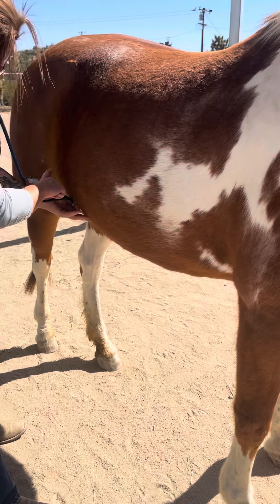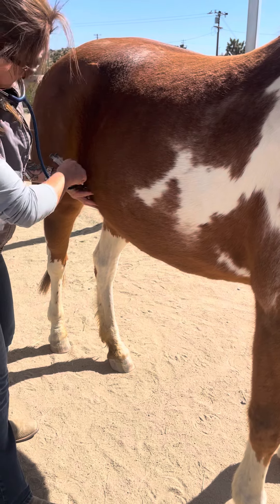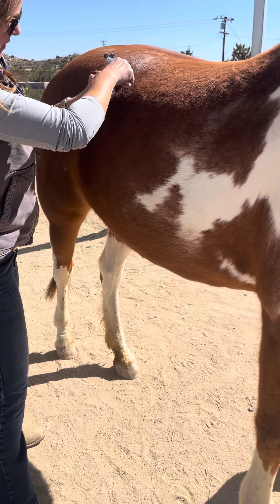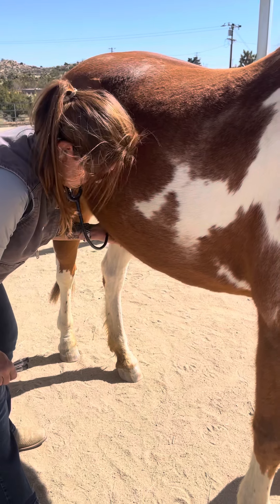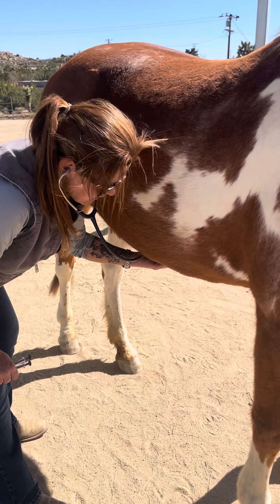Sometimes you can have sand up as far as up here, though it's never usually up here — it's too far up and gravity likes to keep it down low. But when you listen for gut sounds you want to cover this whole area.